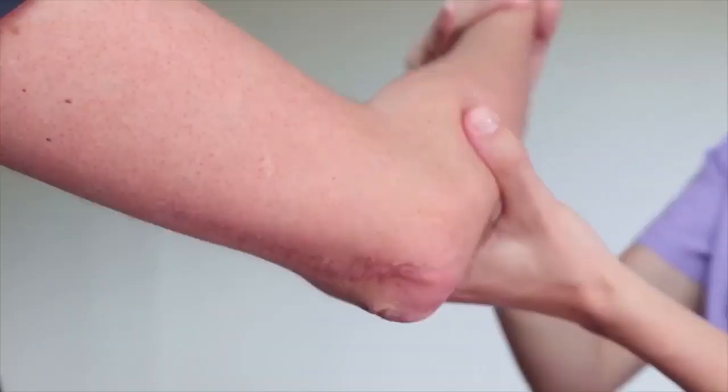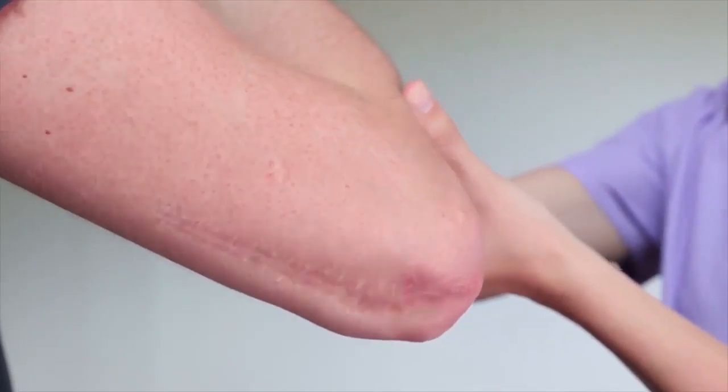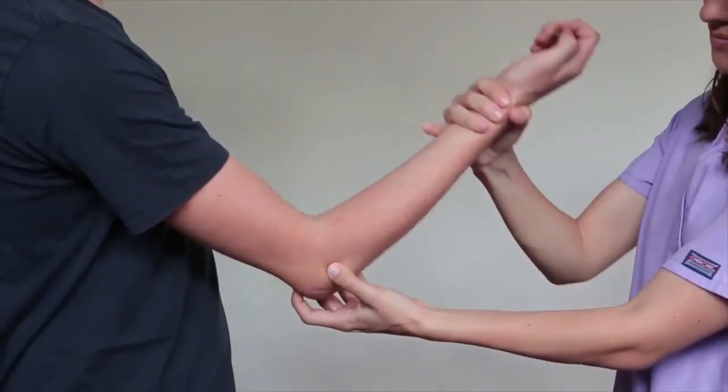This is tedious, labor-intensive work which poses a great strain on patients and therapists alike.